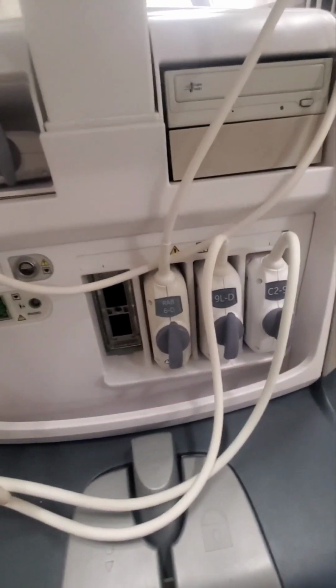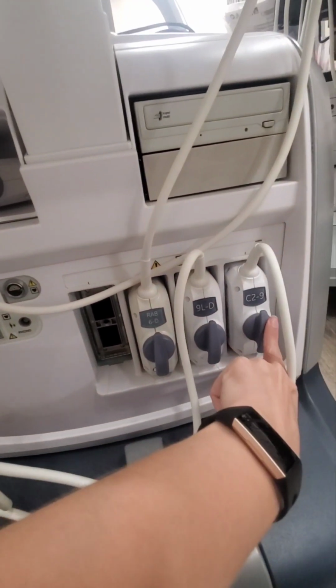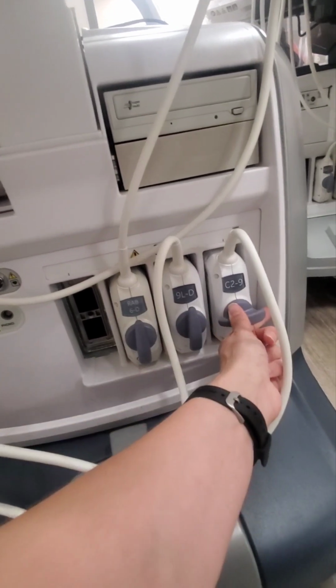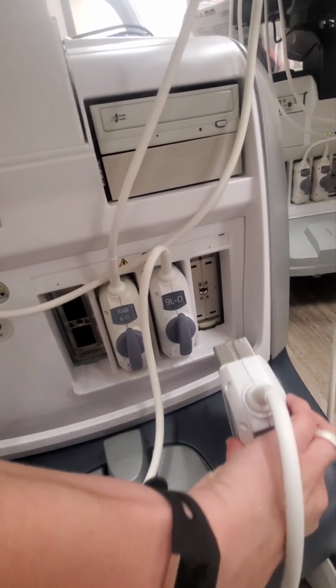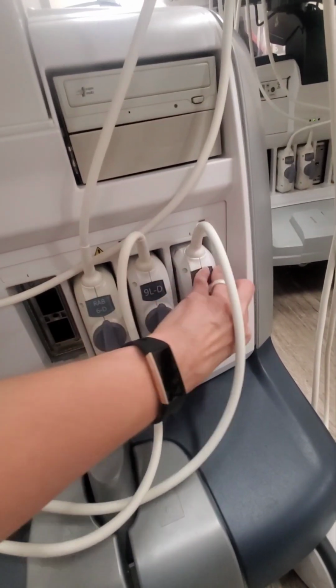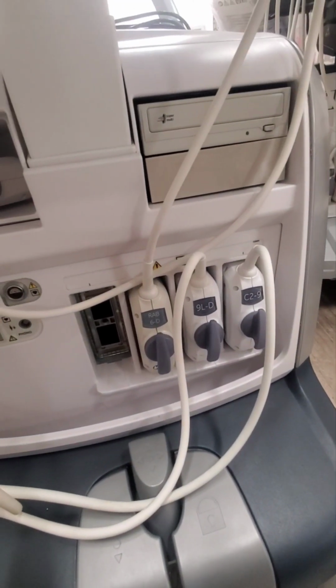Here are the transducer ports, and I want to take out the C9. So it's very easy to do. Just turn this, pull it out. Now say I actually want this one in. Just line it up, push it in, turn the knob, lock it in. Super simple, right?